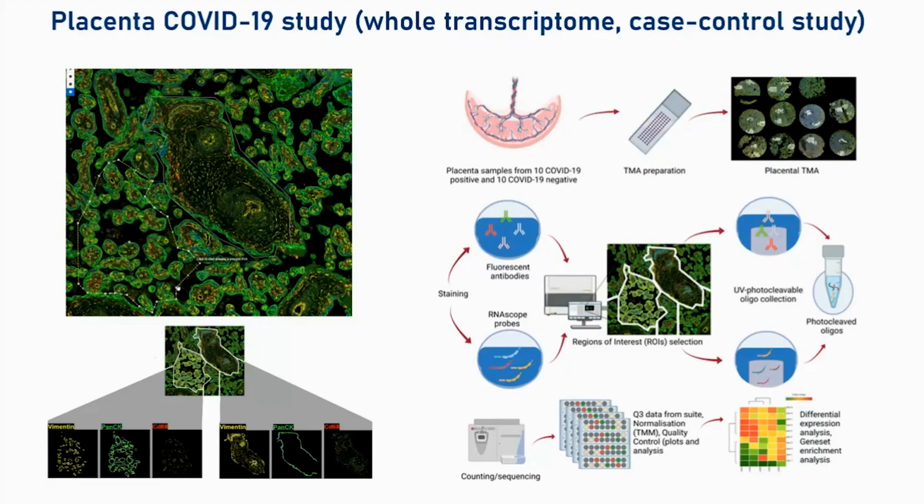We couldn't find virus by RNAscope in these samples, again similar to what we saw in the cardiac tissues. We could only identify virus in the lungs. They were absent in the cardiac and placental and brain tissues. So we think that it is very much localized to the lungs, whereas you are getting the systemic inflammatory response in multiple other organs.